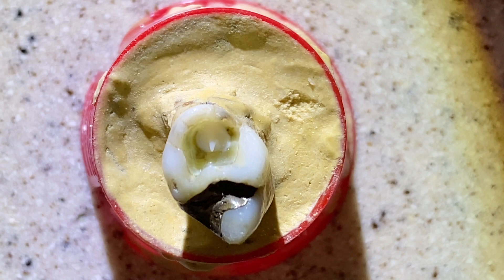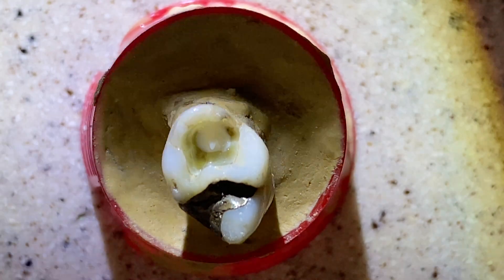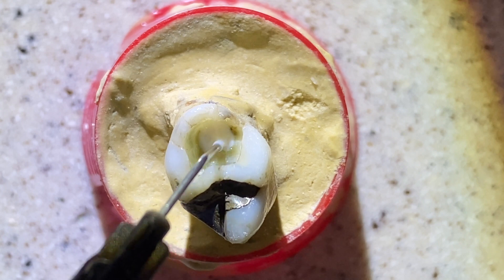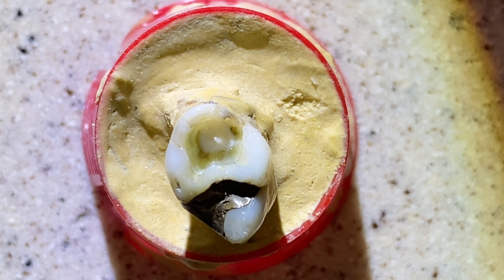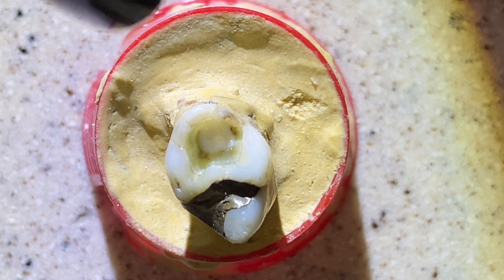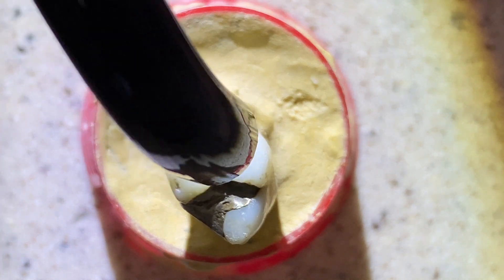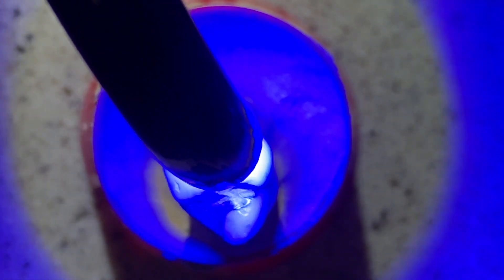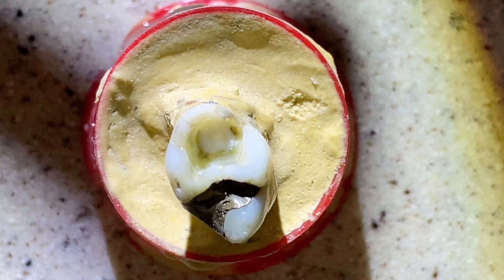Then we let it settle a little bit. We can use the tip to kind of help with that. Once we see that it is pretty much settled into the deepest part, we use our curing light, which you've seen in a previous video, and we set it for 20 seconds. The first beep is at 10, then I touch it again.